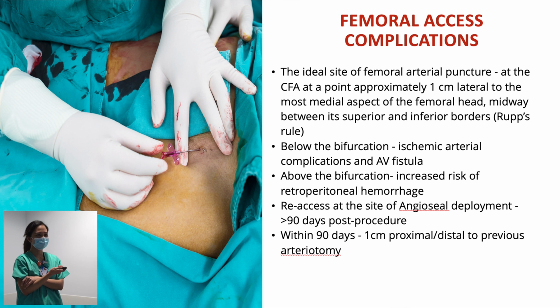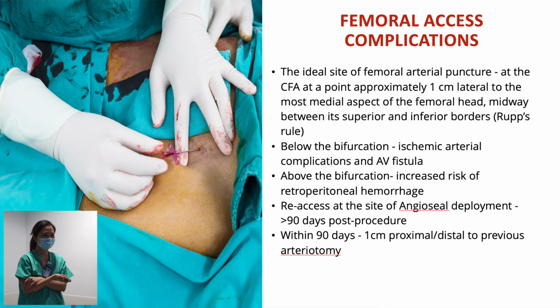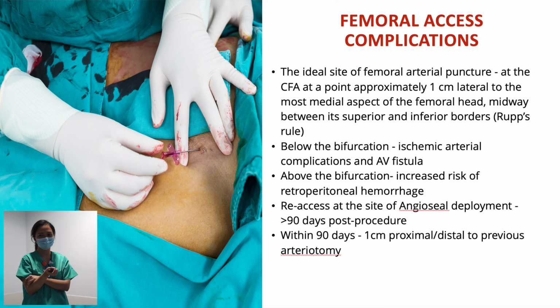So there are complications if the puncture is below or above the bifurcation. You noticed before, when we converted to femoral access, there was a time that the operators were not allowed to do arterial punctures blindly. They usually ask for a sonosite, to prevent these complications.